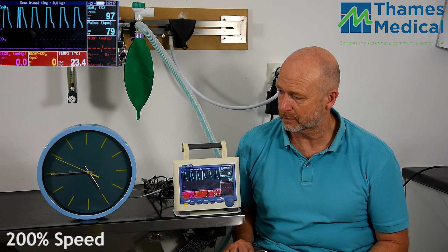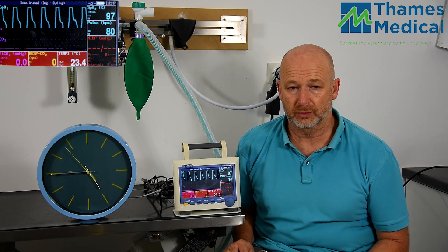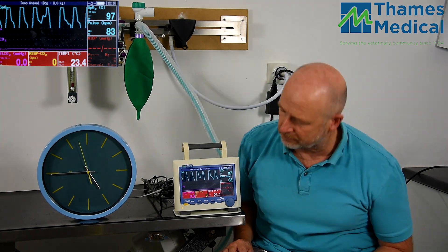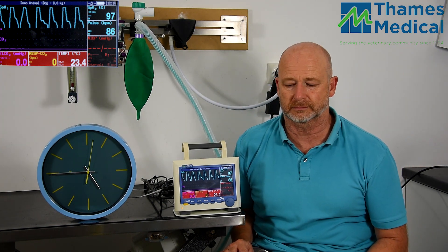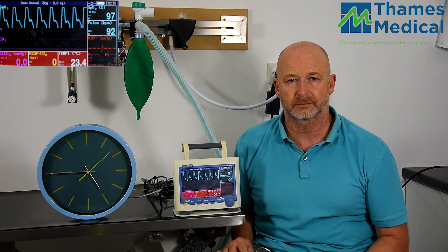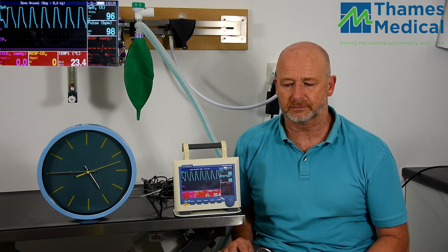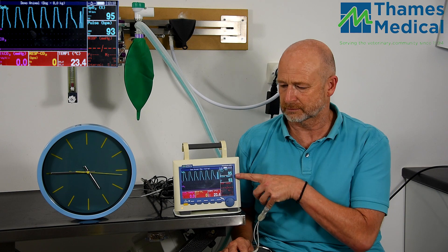This is a short experiment to show the effects of an apnoeic event on saturation, both without pre-oxygenation and with pre-oxygenation. The first one without pre-oxygenation.